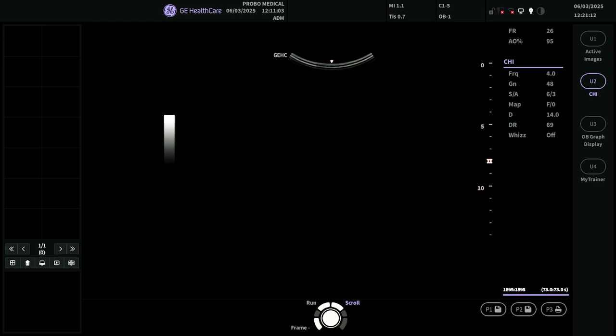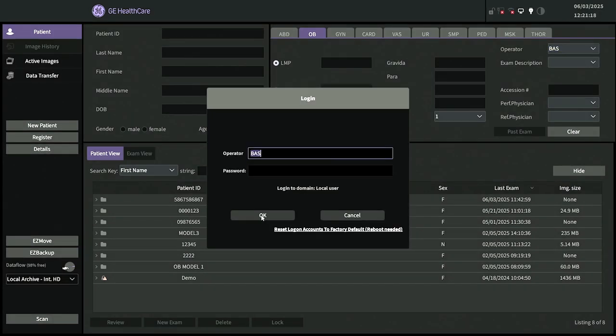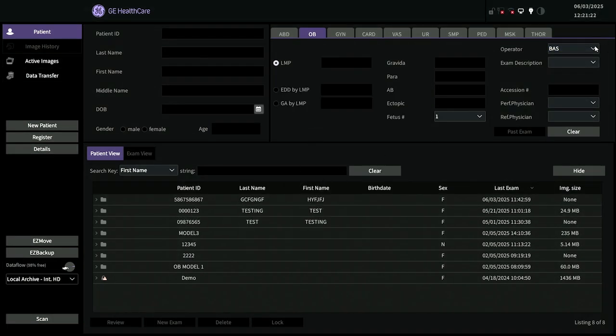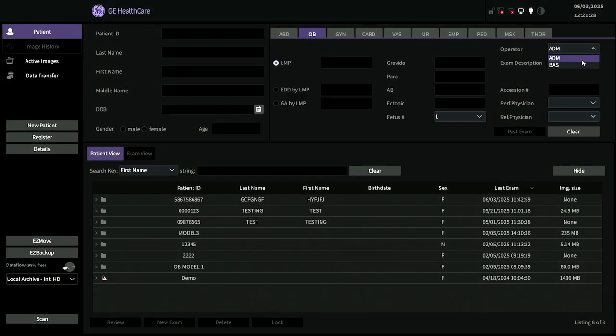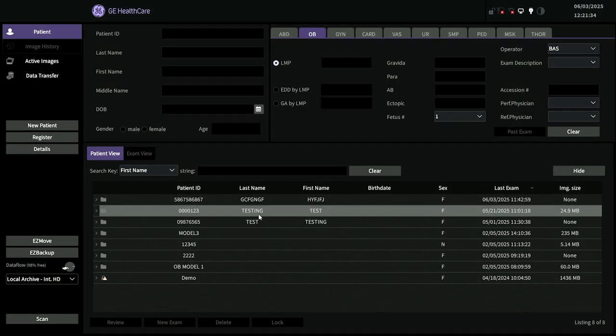And so now when I go to my patient data screen and select, I can hit OK, and that warning is no longer popping up. And so now we're set. All of the warnings are not going to be there. There's no password for this user, and we're good to go.